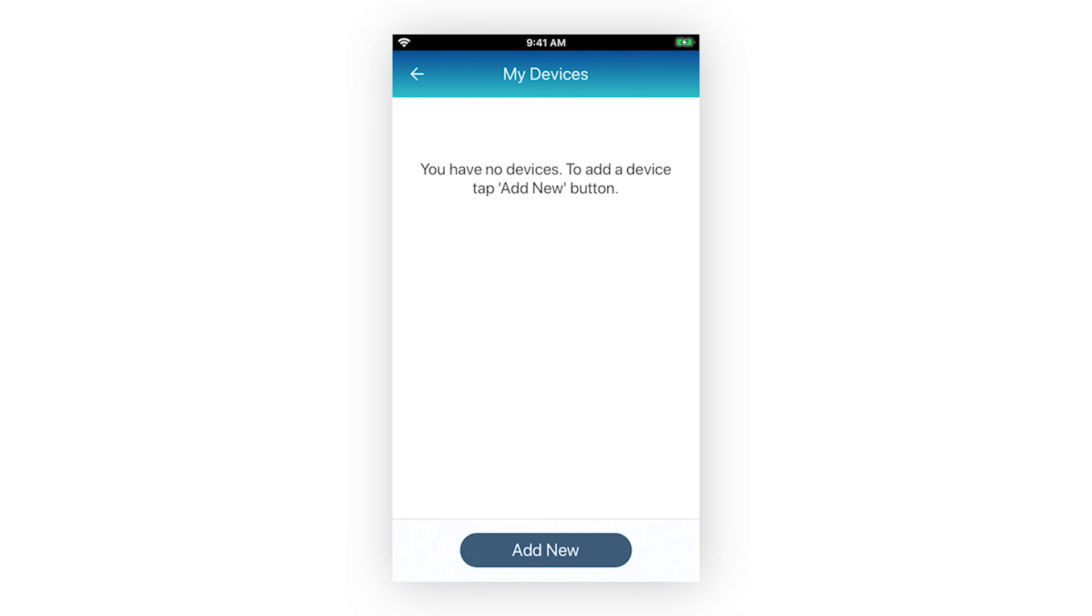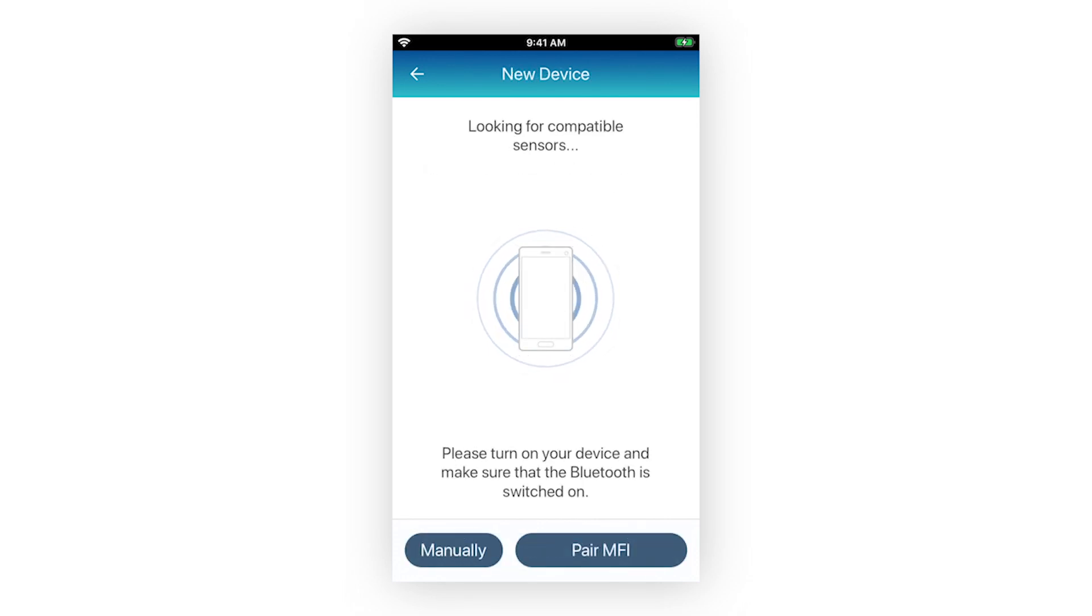Here, you can proceed with pairing your Bluetooth medical devices. Let's show an example. For this example, we will pair the iChoice pulse oximeter. On the My Devices screen, select the button Add New.